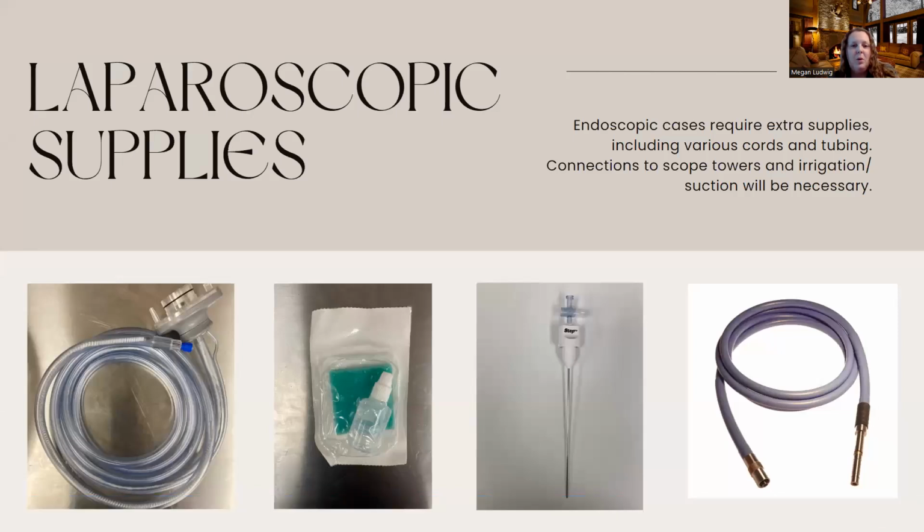Laparoscopic supplies. Along with your basic instruments for your laparoscopic cases, you have some other, typically disposable, items, not always. For example, this one here is not. But like I said at the beginning, there's a lot of extra supplies that go with any type of scope case because you're going to have to be able to see inside.